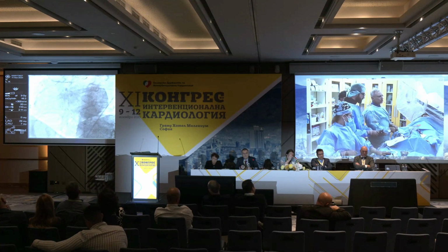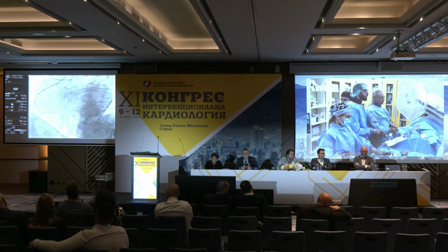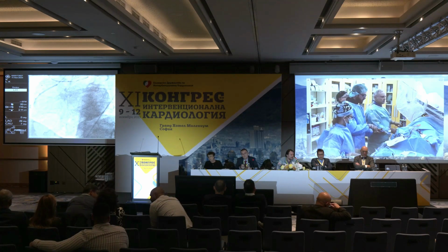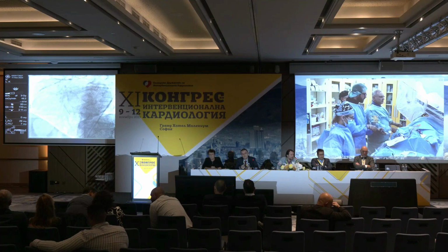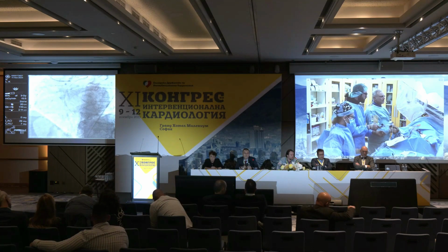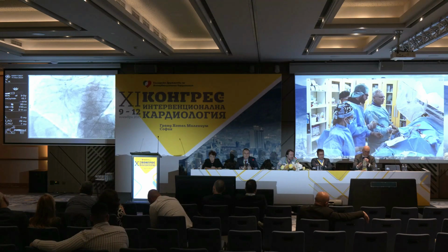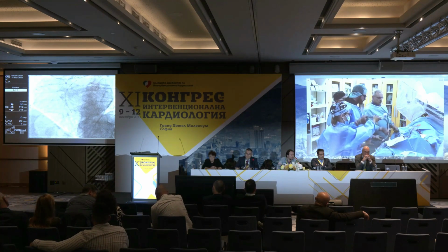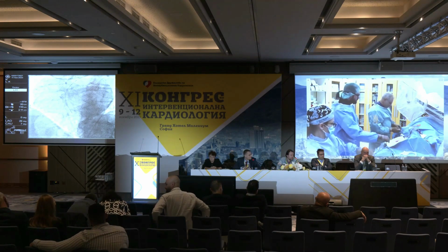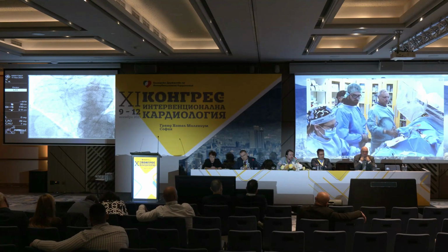And then you're sure that you have done antegrade crossing from the very first moment. Yeah, but the problem is sometimes you don't get enough retrograde filling to see where to put the stent. And if you don't have the IVUS and you don't make the measurements, then you have to use still images from the diagnostic that will orientate you into the direction of where you have to land. Sometimes you spend one more stent if you are not completely accurate, but you have to stabilize the lumen critically.